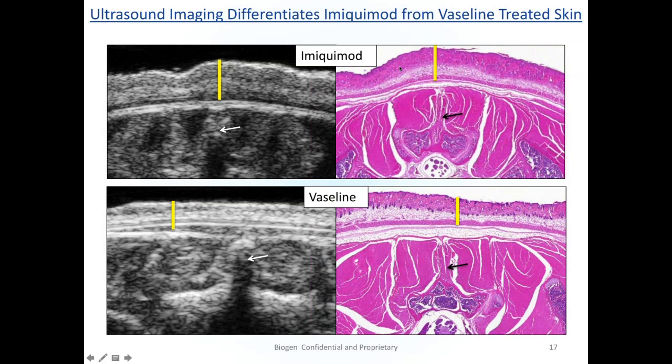At first it was a little confusing, because the histology shows very dense areas of epidermis and dermis, then this adventitial layer, which looks like a loose fatty layer, and then the muscle layer below. So you've got four different features of the tissue in the histology, yet in the ultrasound image it's very hard to distinguish. You can see a little bit of the epidermal layer looks a little different, but for the most part it's hard to identify which regions you're looking at.